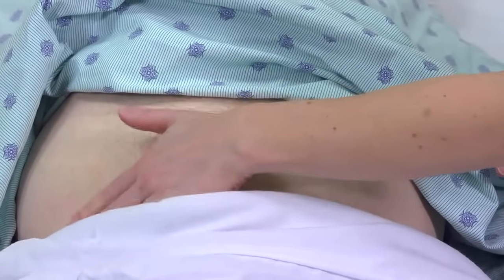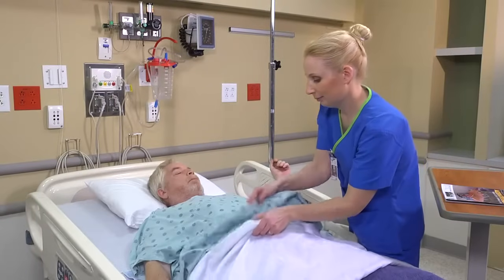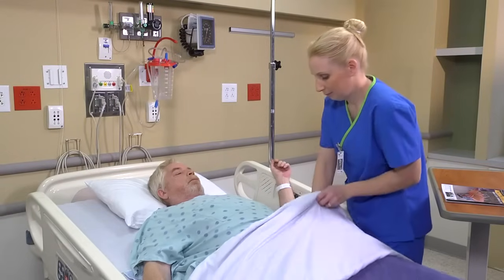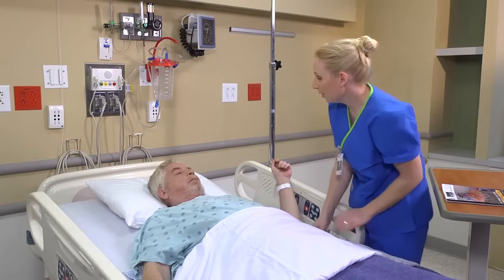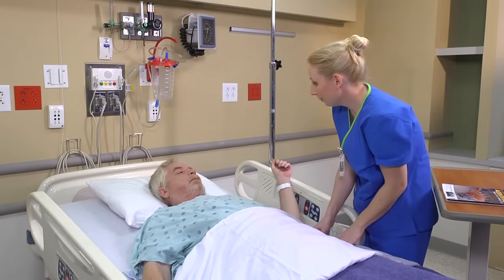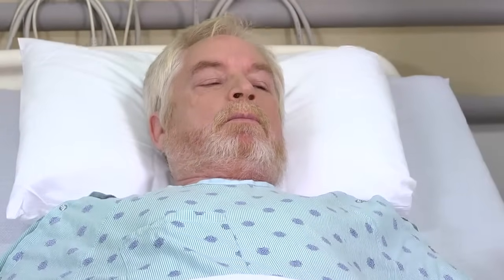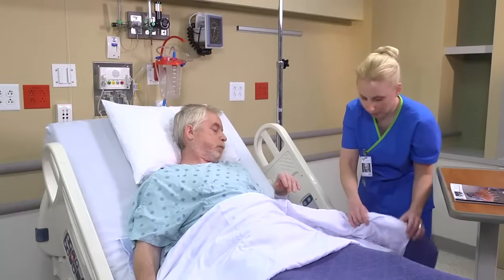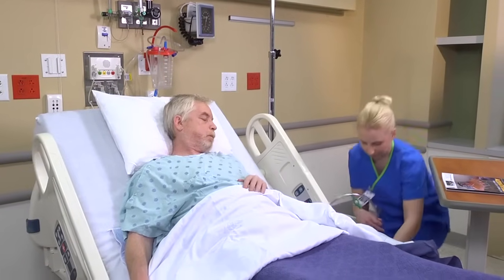Does that feel okay? It's been better. I'm going to go ahead and raise your head back up. I'm just going to check your Foley bag. Check the color, amount, and clarity of the urine.